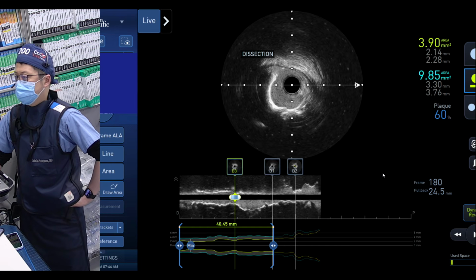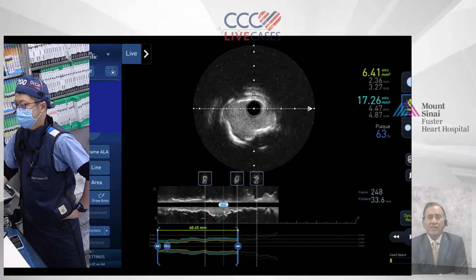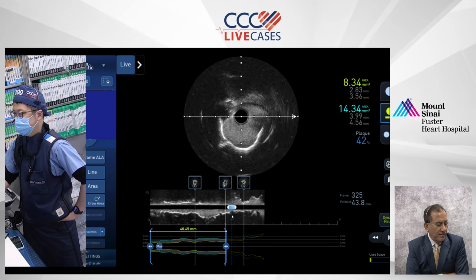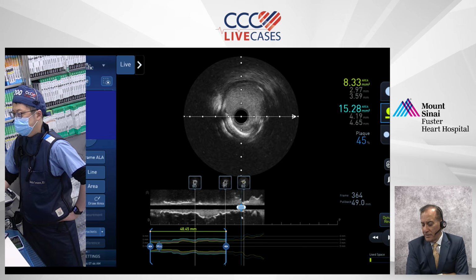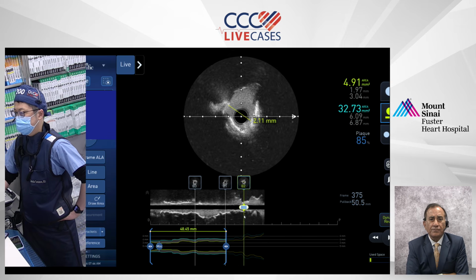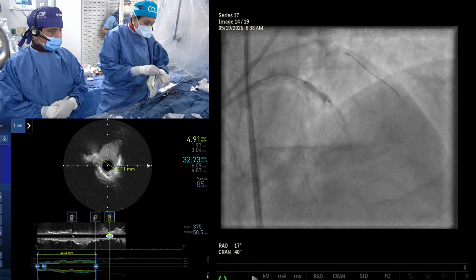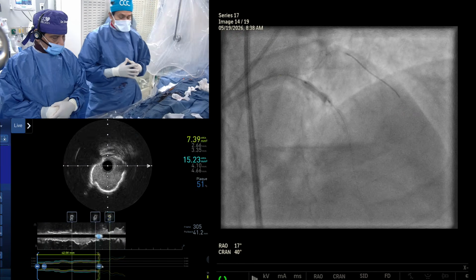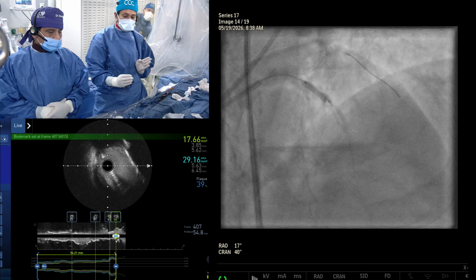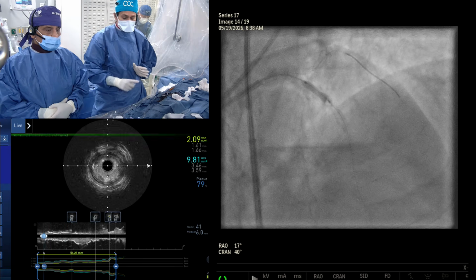Now go back to the proximal LAD. Anu, that's a very delicate balance. In many ways, that is exactly the kind of cut you want, but slightly going beyond gets you into trouble. When we are doing rotational atherectomy, I still think the good old rotational atherectomy is very safe. How the physics principle works, there is deflection of the normal tissue when the rotabar rotates, not orbits.